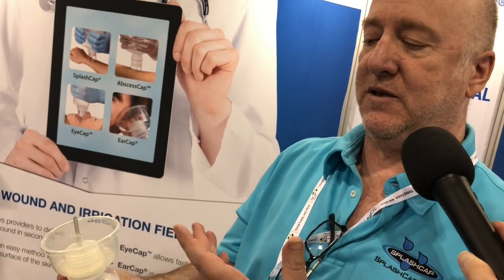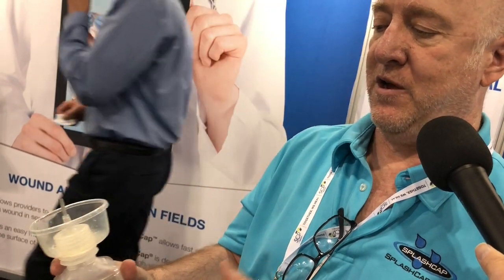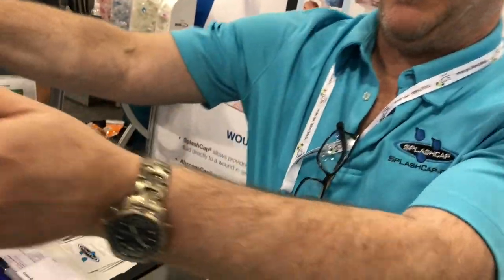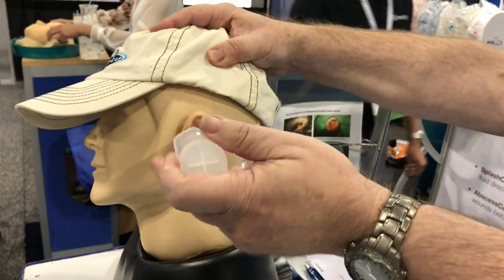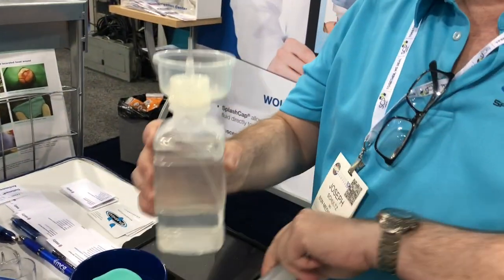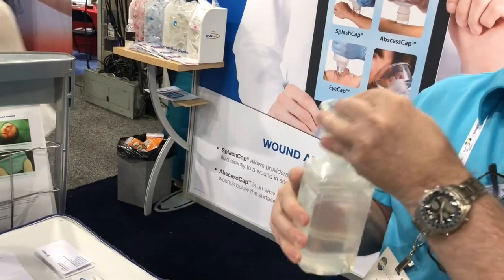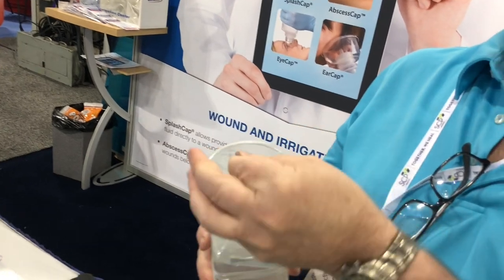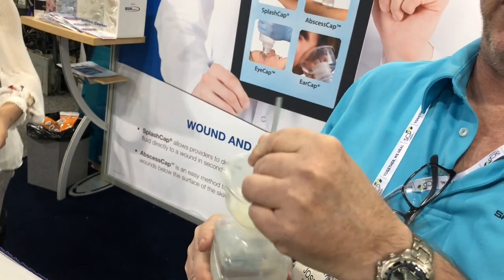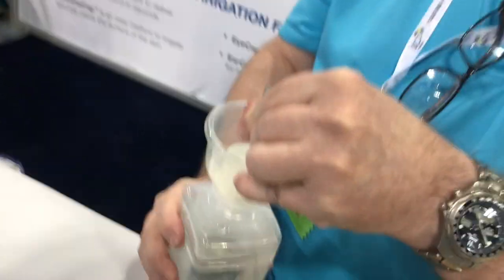There are a couple of different things about this product over any of the ear irrigation methods that have existed. Typically, when you're irrigating the ear, you'd have the patient lean over and squirt water into the ear pushing it down. But with the ear cap, you're going to put this tip into the ear — it's a flexible tip, and you can determine the length by just adjusting it yourself, because people have different depths and different shaped ear canals.